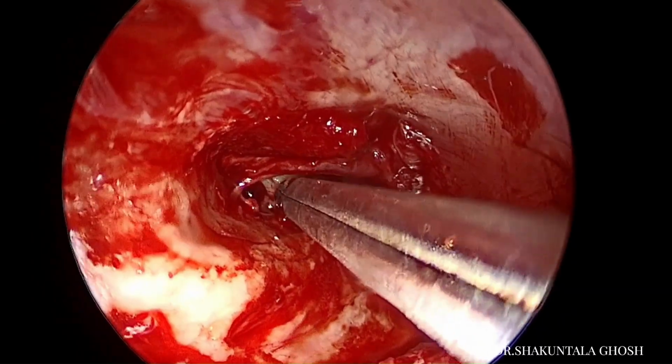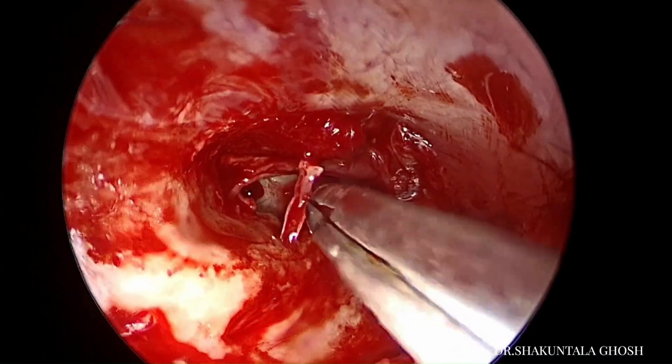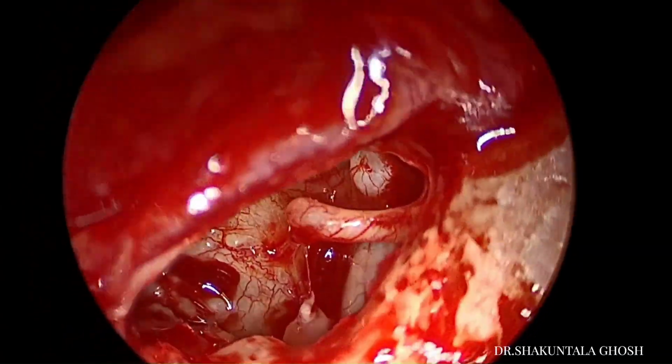And now I am going to take out the stapes suprastructure, the head, neck and the two crura.